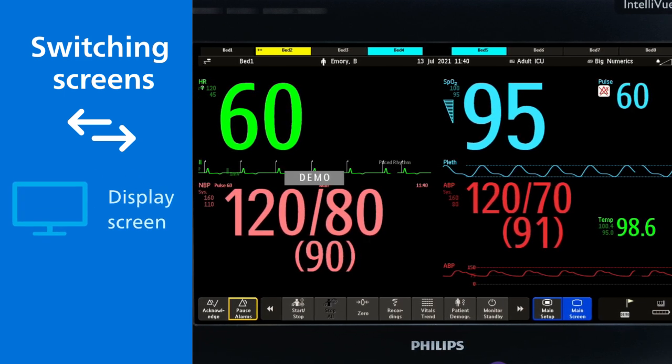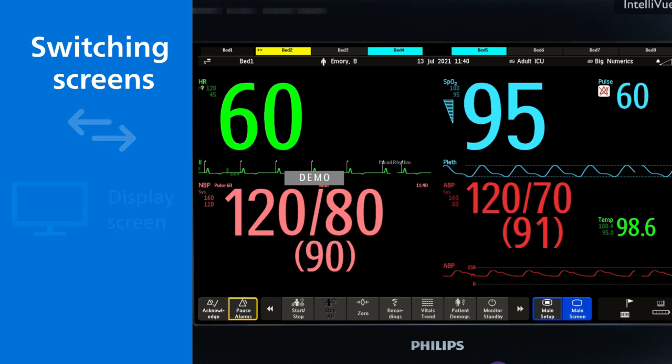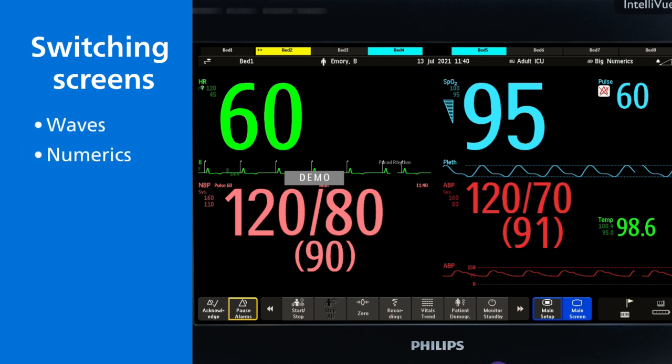Each screen is designed to display patient data in a specific order, such as waves, numerics, trends and specials, such as a timer or clock.